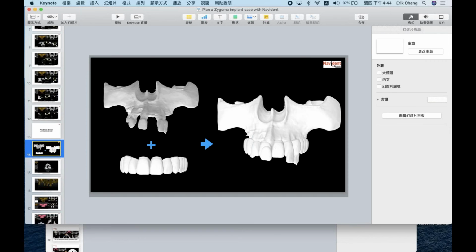Is this therefore the protocol that is followed? Yes. So it goes through the analogic models where the vertical dimension is understood, and I can see radiopaque spots, which can then be used to do the matching with the diagnostic setup. Yes. Okay, good. Now I understand.